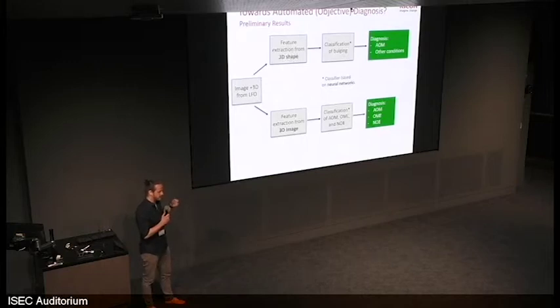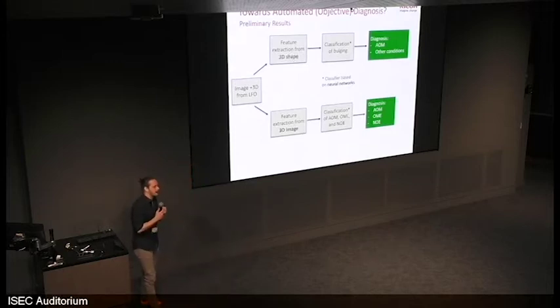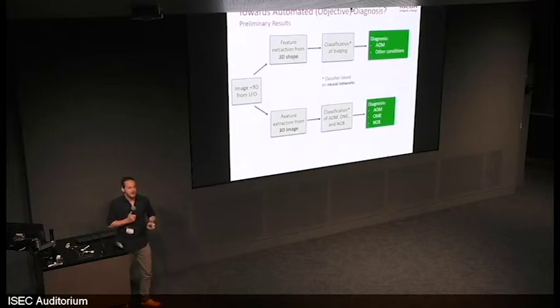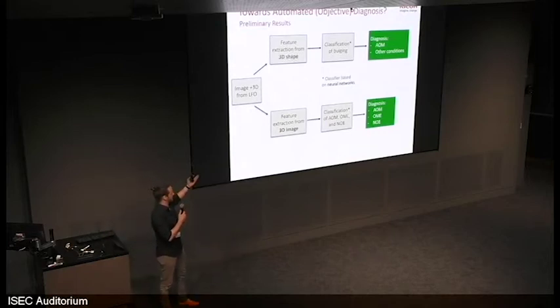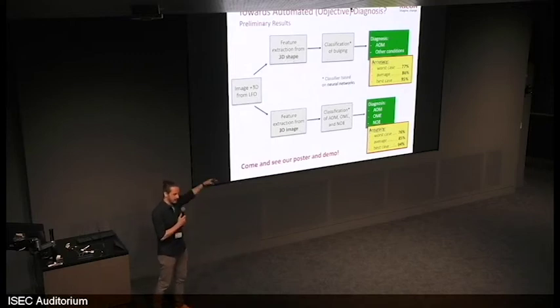It's a bit challenging, because doctors don't want to go from basically deciding to not deciding, right? So we designed two paths. The first, at the top, is where we classify some features, for example bulging, and then the doctor will take the final decision. So we're just assisting the doctor. In the second case, we actually classify the different types. And here I give you some preliminary results on the worst case, average, and best case for each of those two.